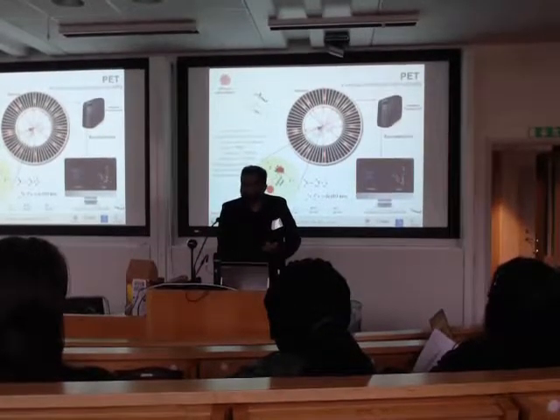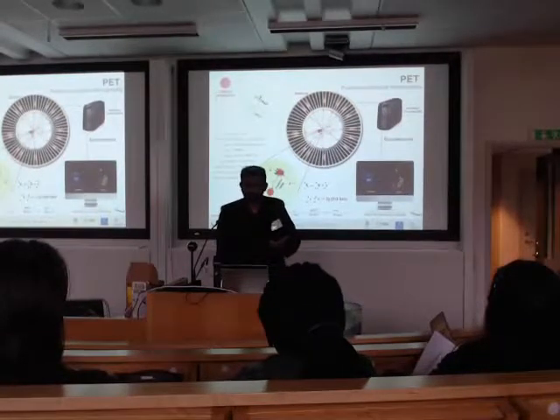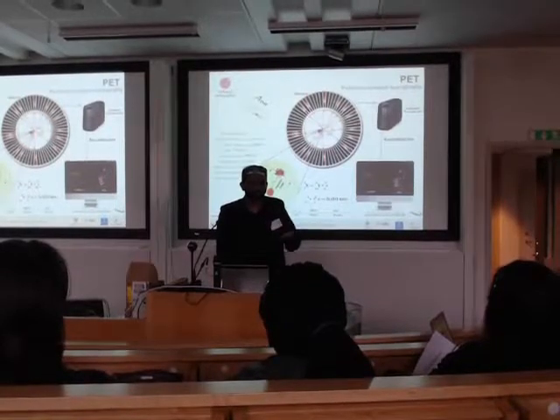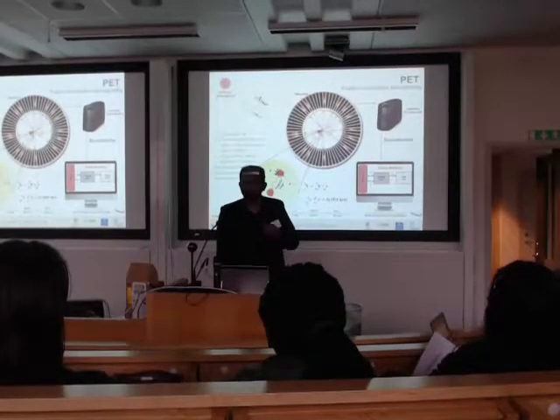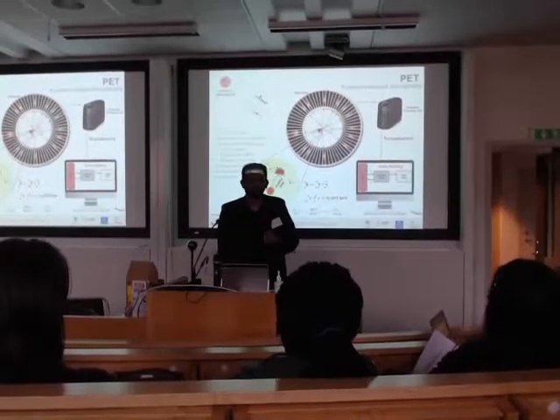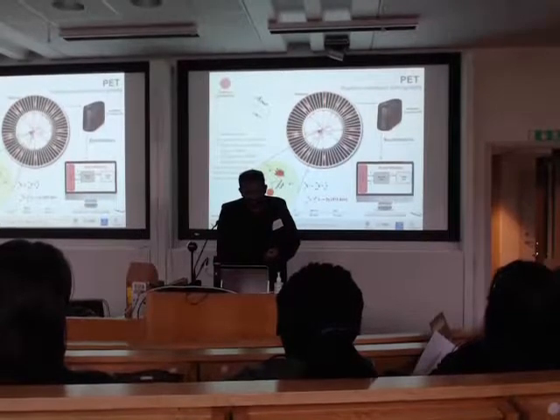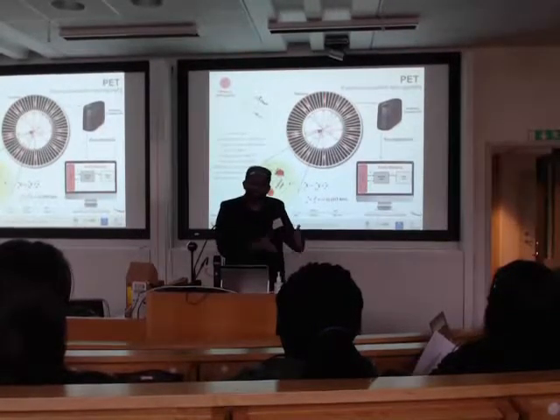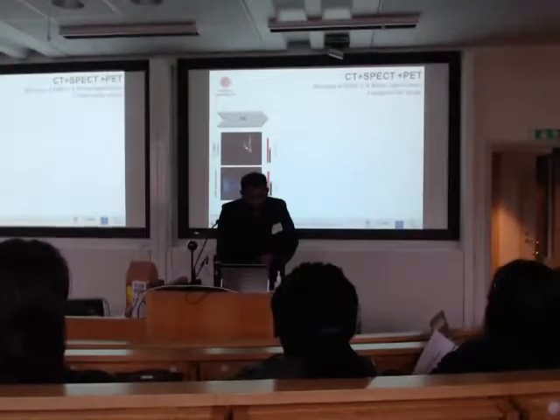So not just for visualization, you can also perform quantification with the PET. You can get numbers, what's the tracer kinetics of your tracer at different parts of the body. And you can also use this data to perform kinetic modeling, which is much more important in the pharmaceutical industries. So we have that CT, SPECT, and PET. So now you have the PET data.